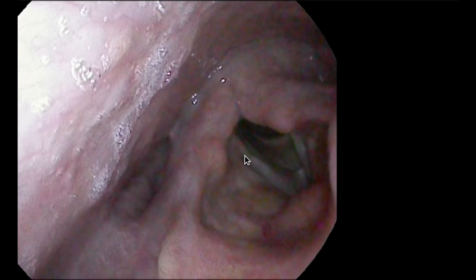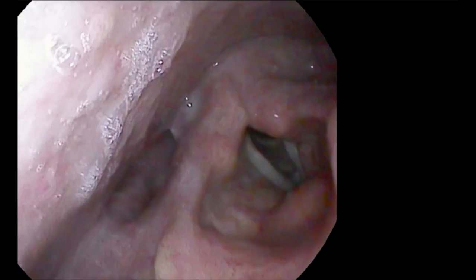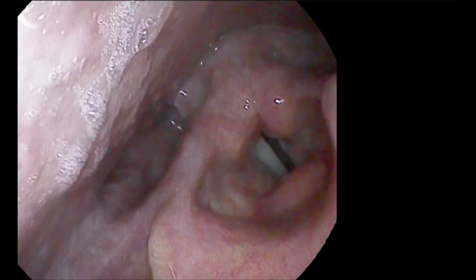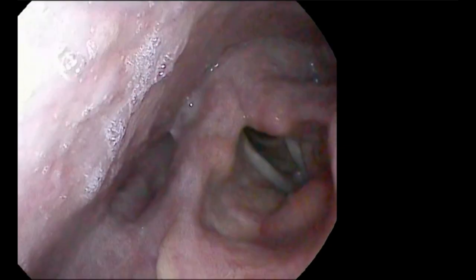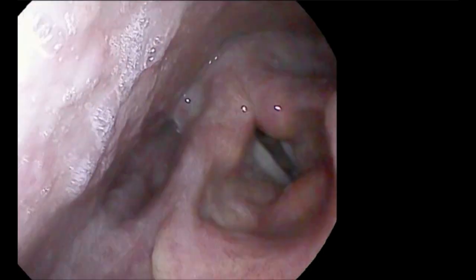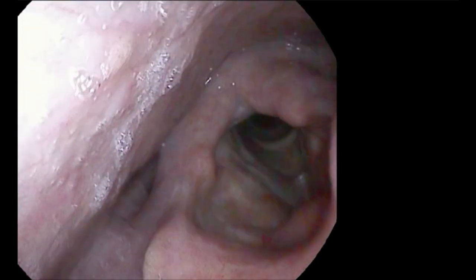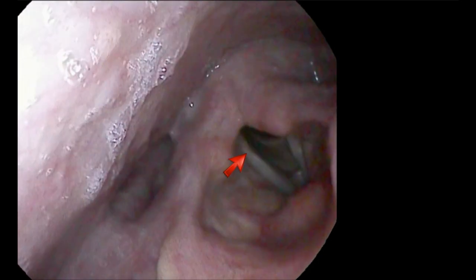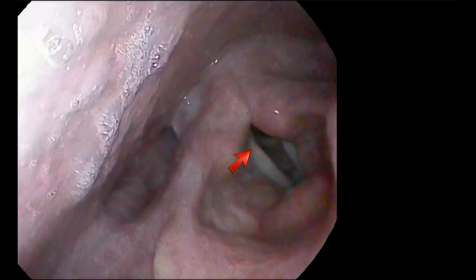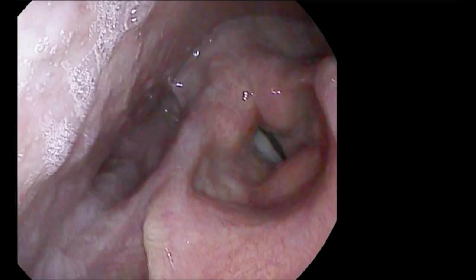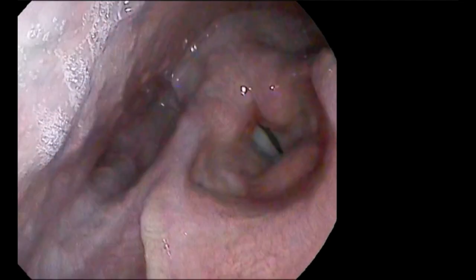What I want to look at here is the right vocal process. Watch as I slow this down and go frame by frame. The right vocal process translates — that is, it moves medial — but it doesn't rotate. The tip of the vocal process never comes towards the midline. So that gives us one clue.